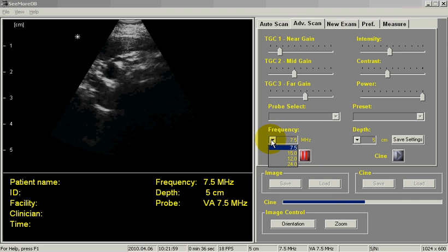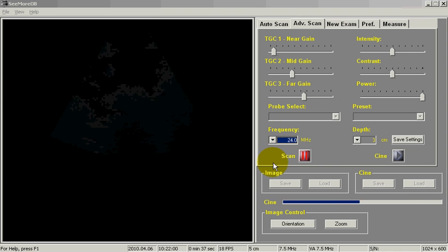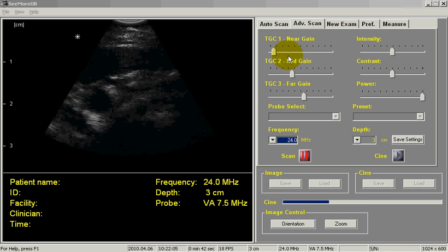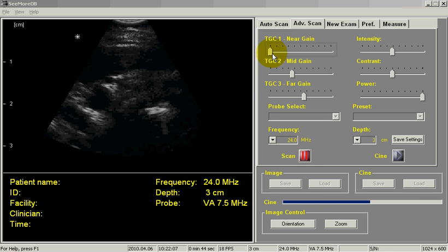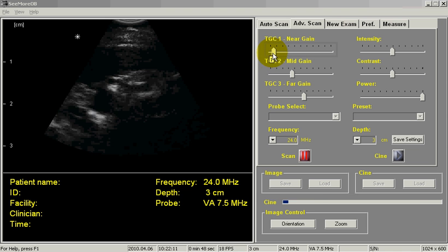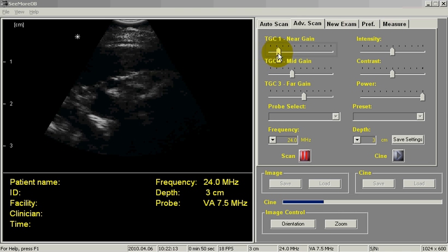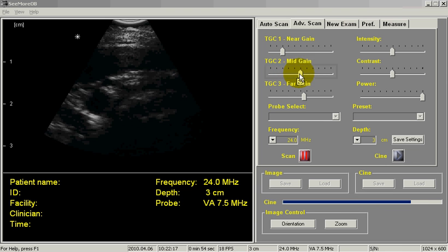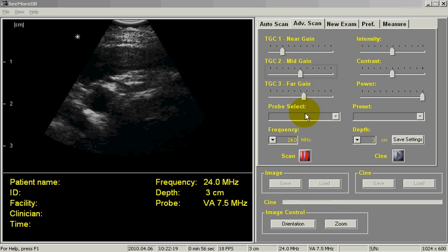Notice when I switch the frequency to 24 MHz, my depth changes because I don't have the same penetration. Again, I'll start with the DGC1, and I adjust this just until I start to get a little bloom in the near field, and then I can adjust the mid gain and the far gain to get the desired image.